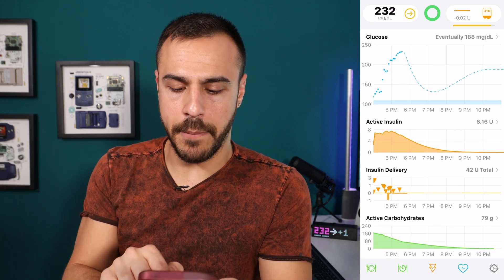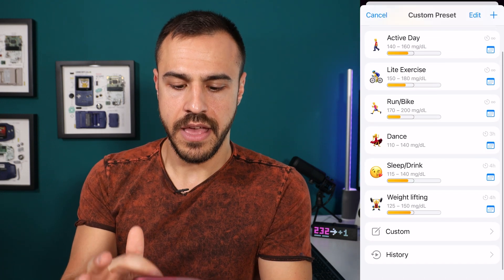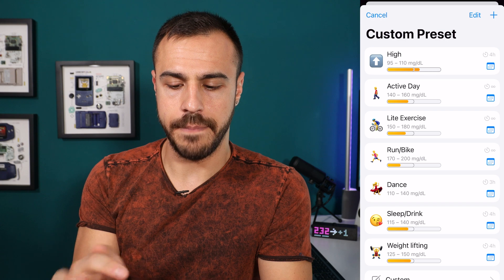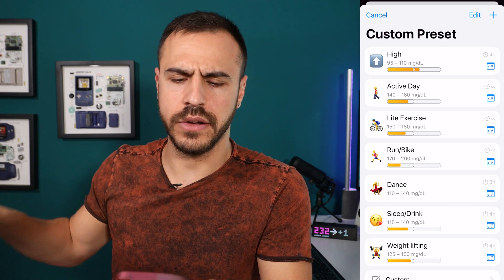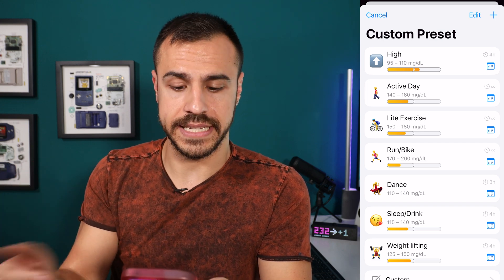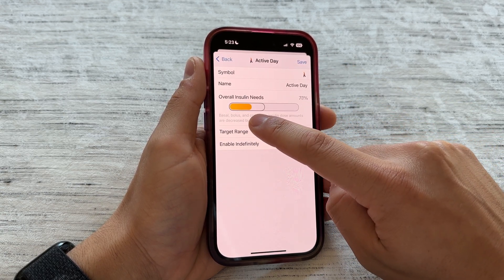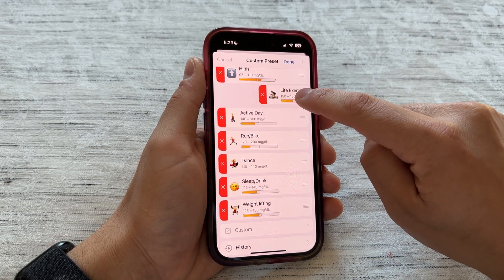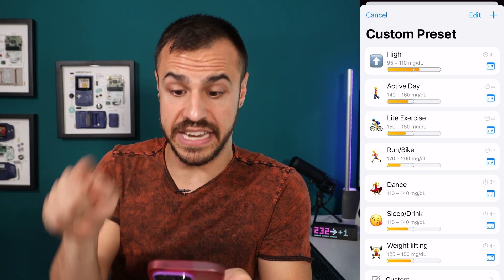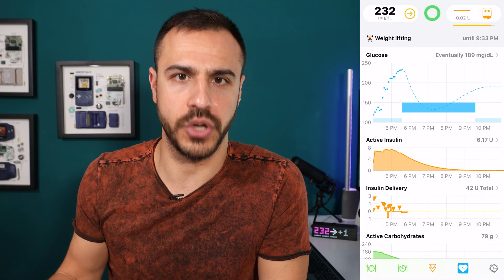Now I'm going to skip over to the heart icon because I need to put my temp override back on. When I click that, these are all the temp overrides I have — all for different activities. I currently have it on active day, meaning I'm going to go work out. It's going to hold back my basal and set my target range to 140 through 160. These are all completely customizable. I've created ones for when I'm high, when I go on a run or bike ride, when I go dancing, and weightlifting. You can set different hours — I put four hours for some, and infinity for others until I turn them off.